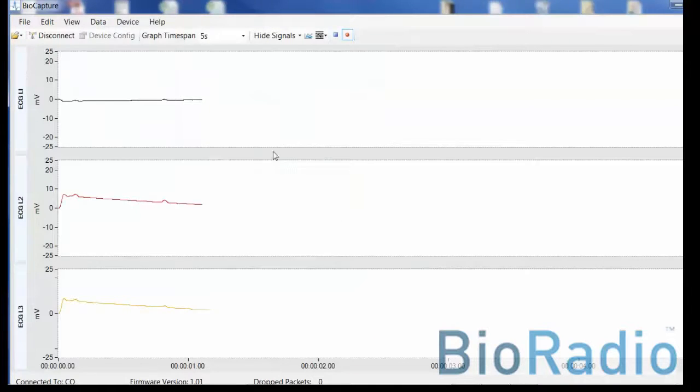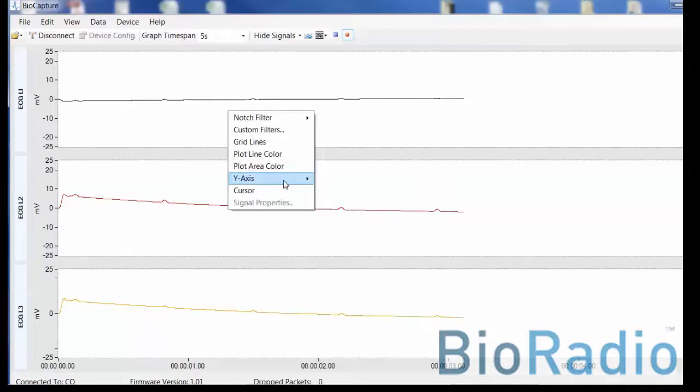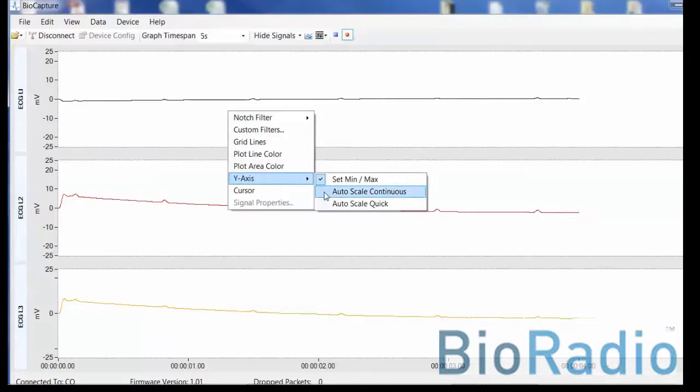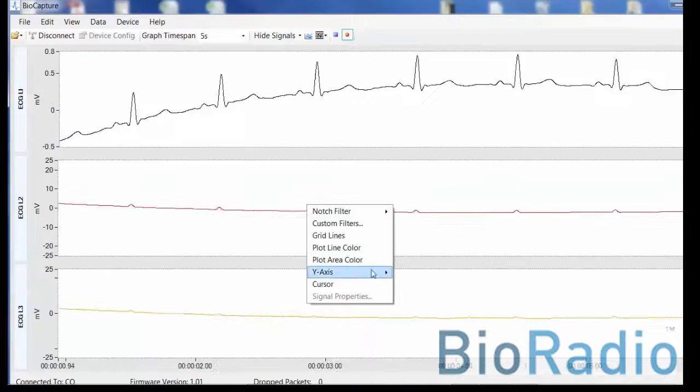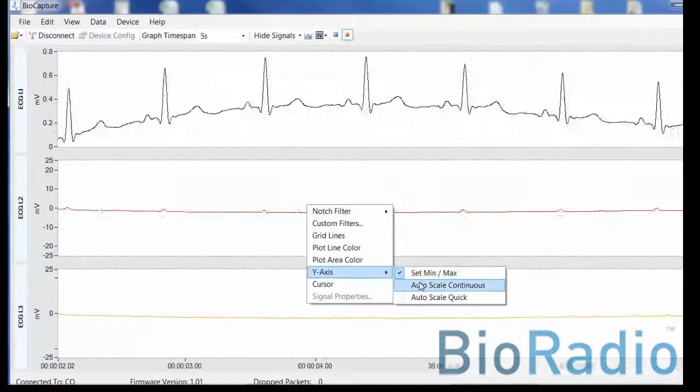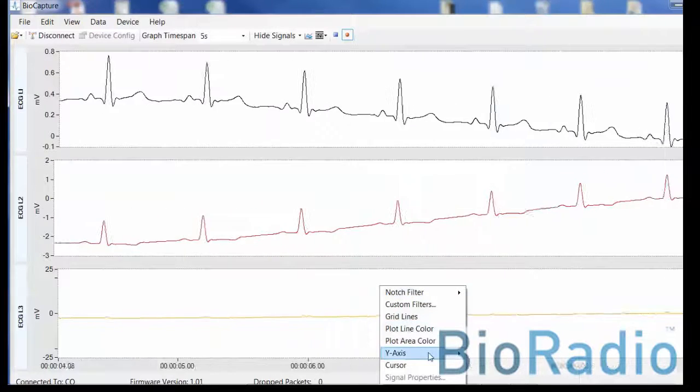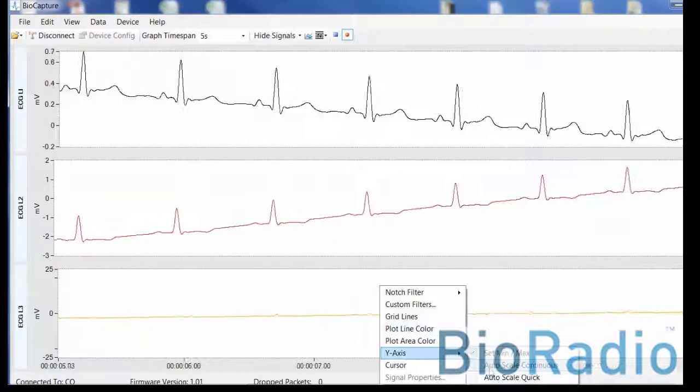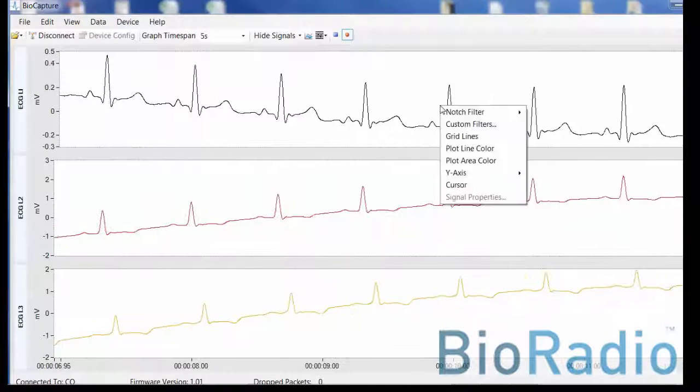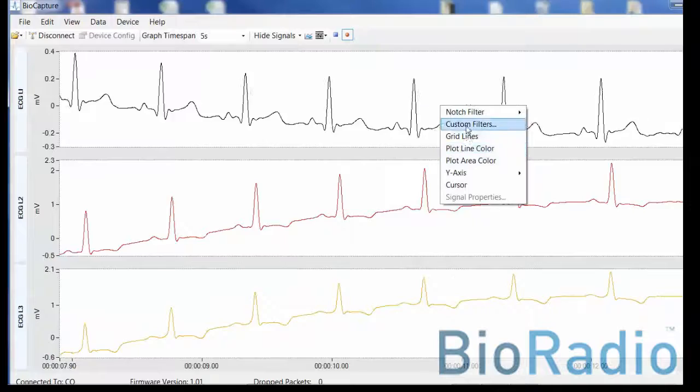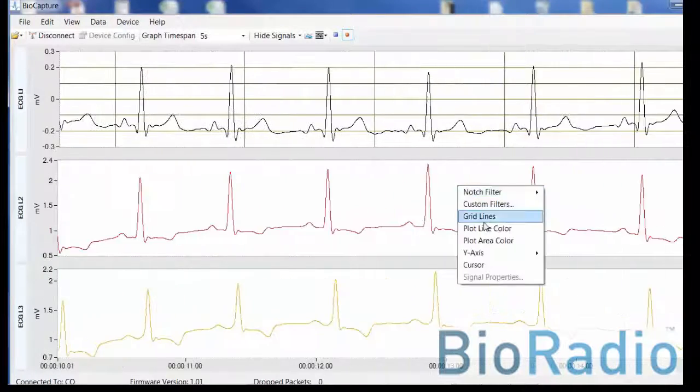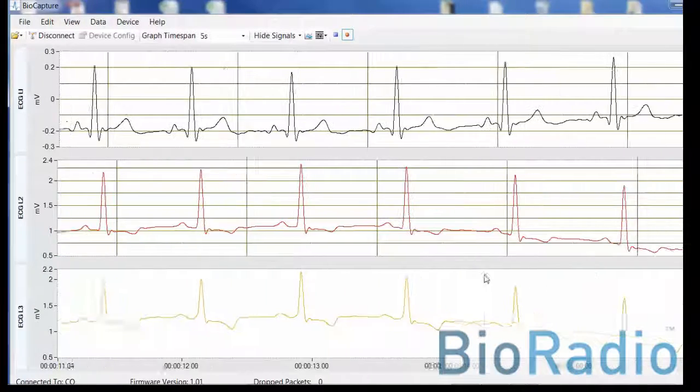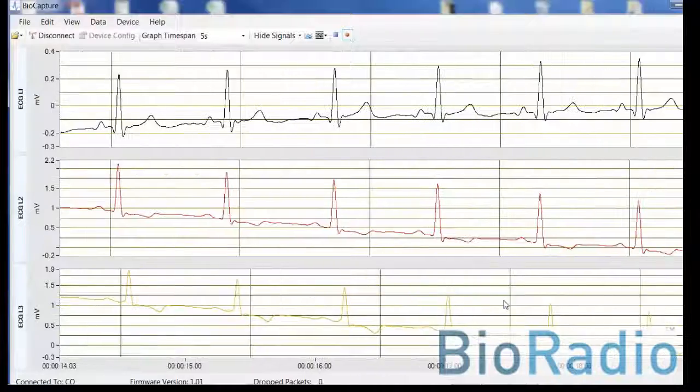Automatically, you will begin to acquire data. You can scale your data by right-clicking on any channel and selecting the y-axis. In this demo, we will use select continuous. You can graphically add grids to your channels.